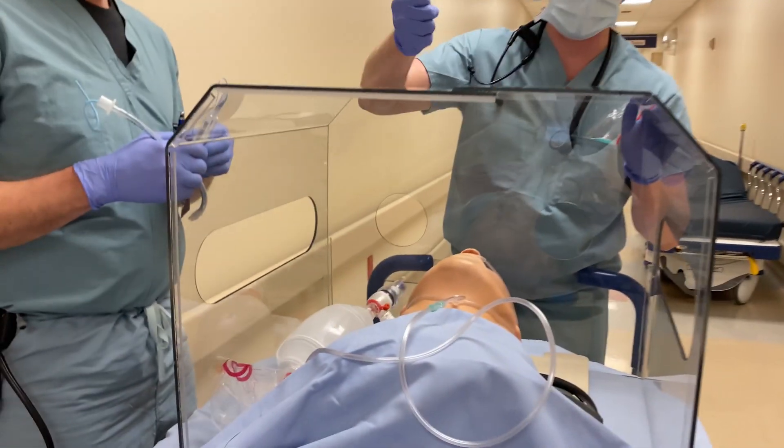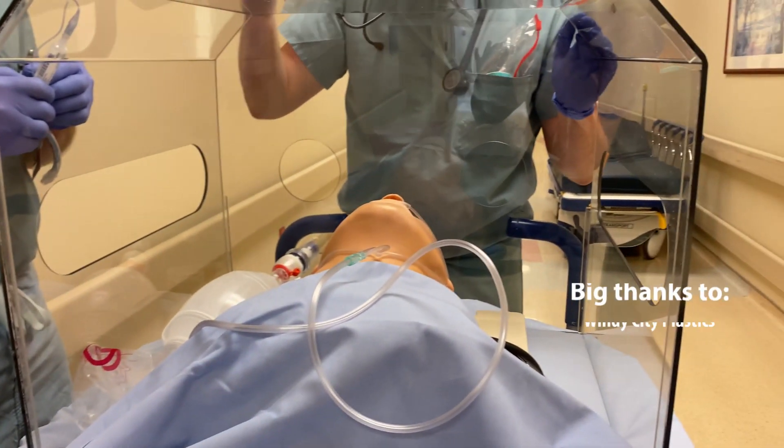It's a polycarbonate, cabin wipe safe, bleach safe, so you can clean it off every time you use it.